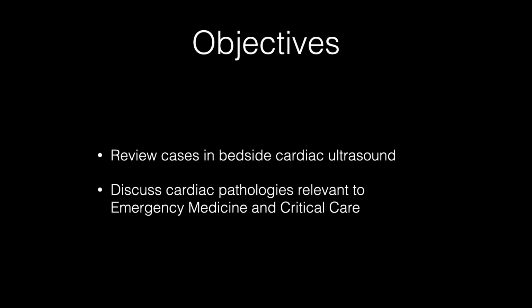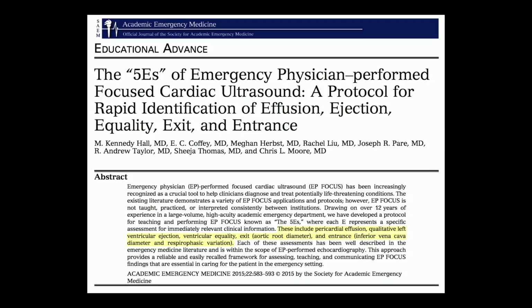This article is probably one of the best I've read about how to do bedside cardiac ultrasound in the emergency department or the critical care environment. If you haven't read it, I highly recommend that you pull it and read through it. It was published in Academic Emergency Medicine a few years ago by the folks out of Yale, and they did a great job of summarizing basic cardiac ultrasound and what you want to look for, dividing it into 5 distinct categories where we can go to the bedside, put our probe down, and get pretty decent yes or no answers with a little bit of grading.